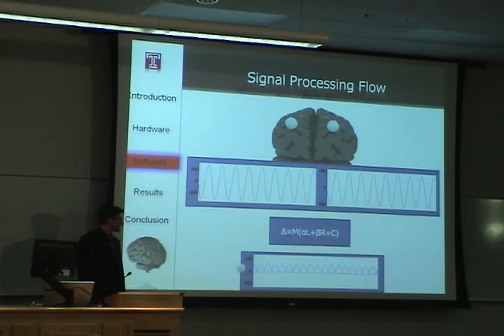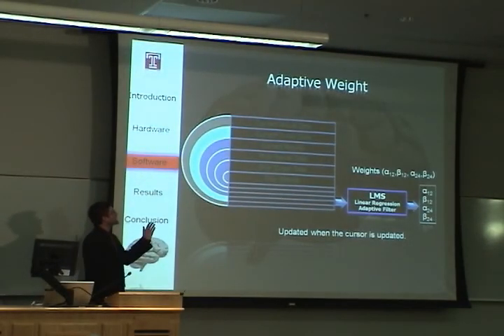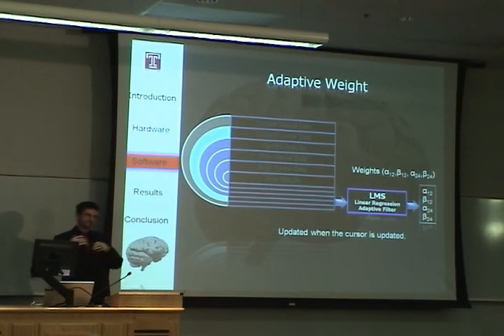One of the interesting aspects of this project is that this equation alone is not enough in order for everything to work as a whole. We also have to have a point where it's going to adapt itself. While the person's trying to learn, the system's trying to learn the person.